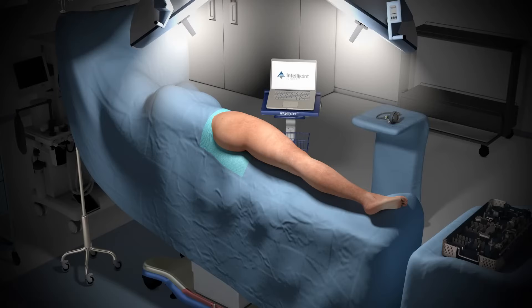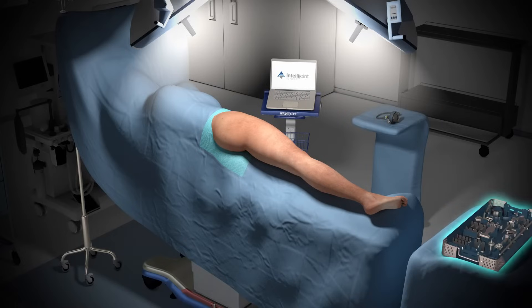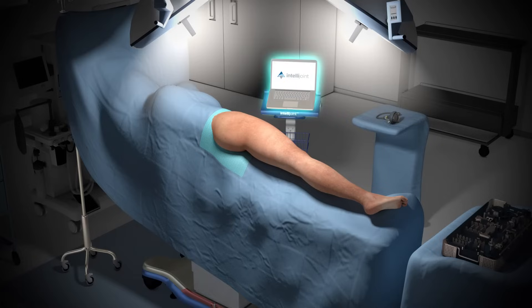The IntelliJoint HIP system consists of a miniature camera that resides inside the sterile field, a single tray of instruments, and a laptop computer.